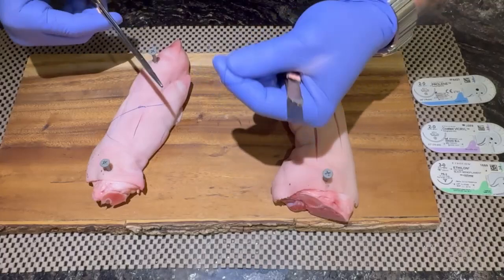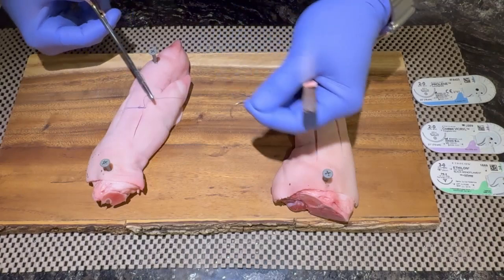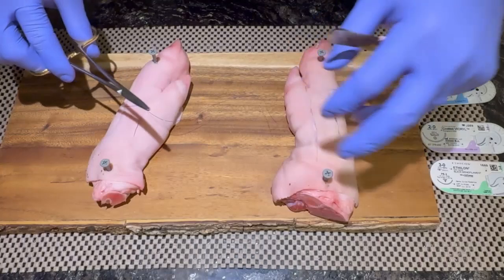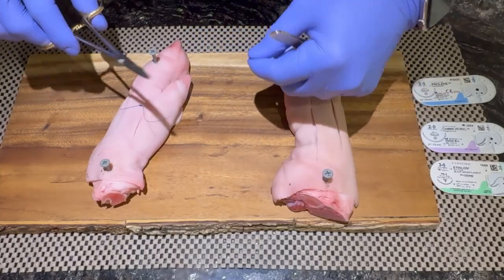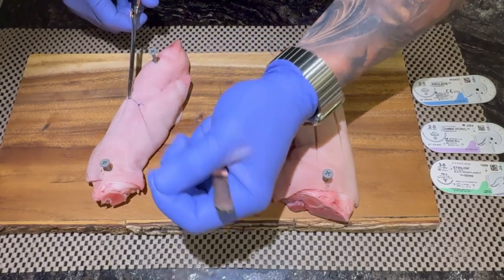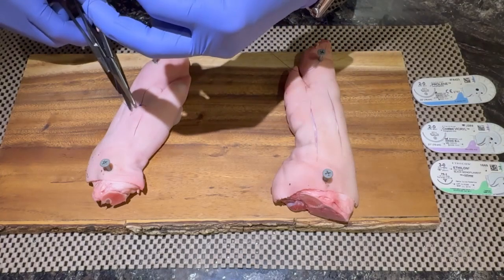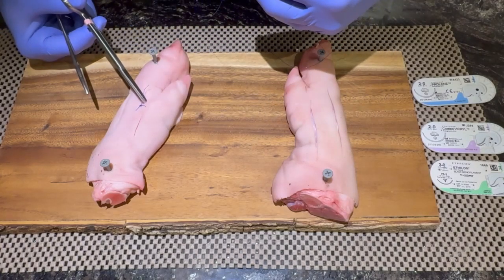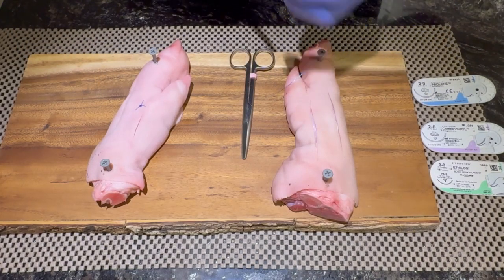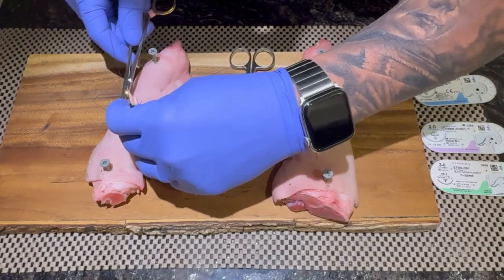We now reverse it the other way. We loop it the other way only one time, grab the corner, and we have a knot. And then we do a third and final step: loop in front, grab it at the corner, and finish the knot. Cut the edges of the suture at about 5 to 6 millimeters, and we repeat our steps until our wound is completely closed.